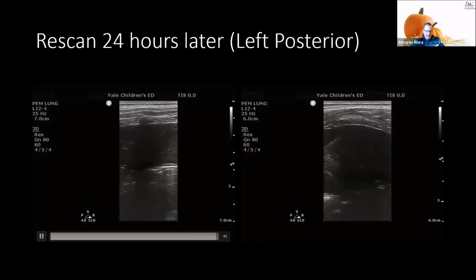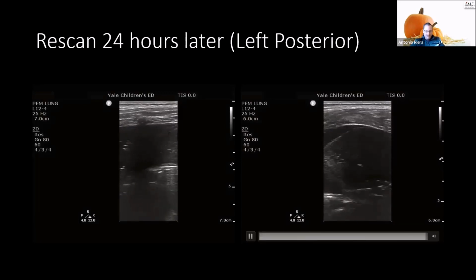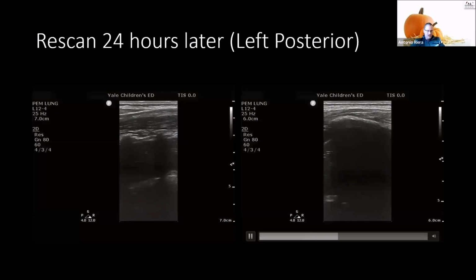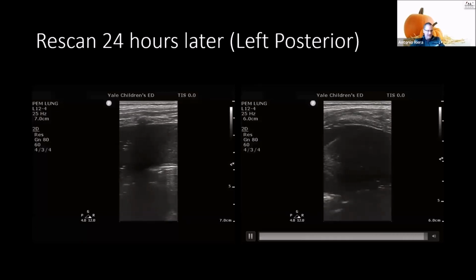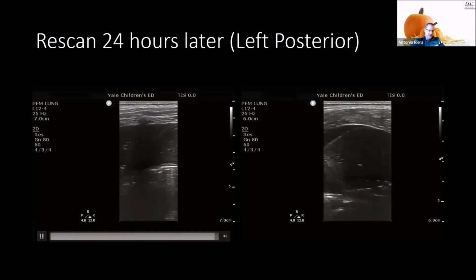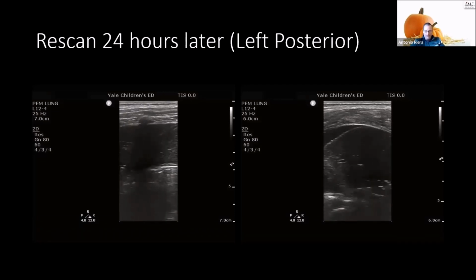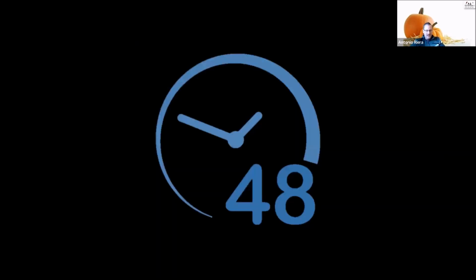And you can see a very tiny pleural effusion here in front of this consolidation, which again, I was very surprised to see just given that x-ray. And here we have spleen, diaphragm there, and that pneumonia sitting on top of the spleen there on the left side. And she was in the hospital for 48 hours on that treatment, Flovent, azithromycin. She was watched for a full 24 hours off oxygen, which was reasonable given this is her 3rd admission.